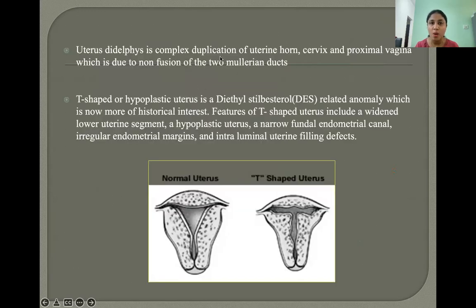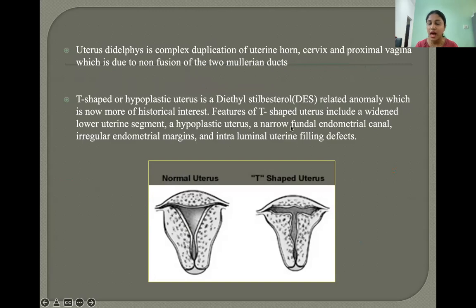Uterus didelphys involves complete duplication of the uterine horn, cervix, and proximal vagina due to non-fusion of the two Mullerian ducts. The T-shaped or hypoplastic uterus is a diethylstilbestrol-related anomaly, now more of historical interest. Features include a wide lower uterine segment, a narrow fundal endometrial canal, irregular endometrial margins, and intraluminal uterine filling defects.